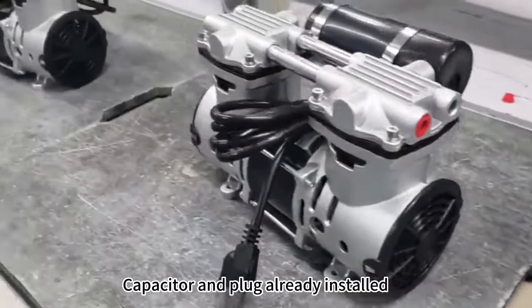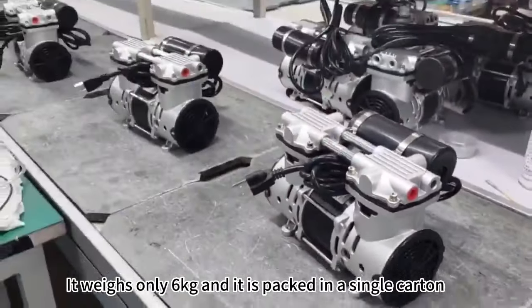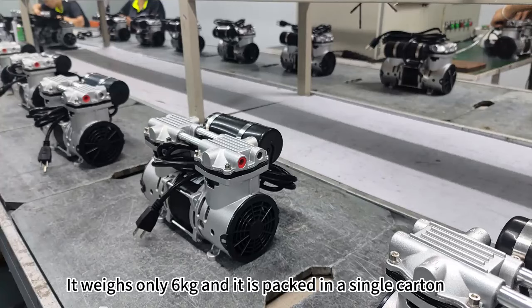Capacitor and plug are already installed. Connect the power supply and you can use it. It weighs only 6 kilograms and is packed in a single carton.